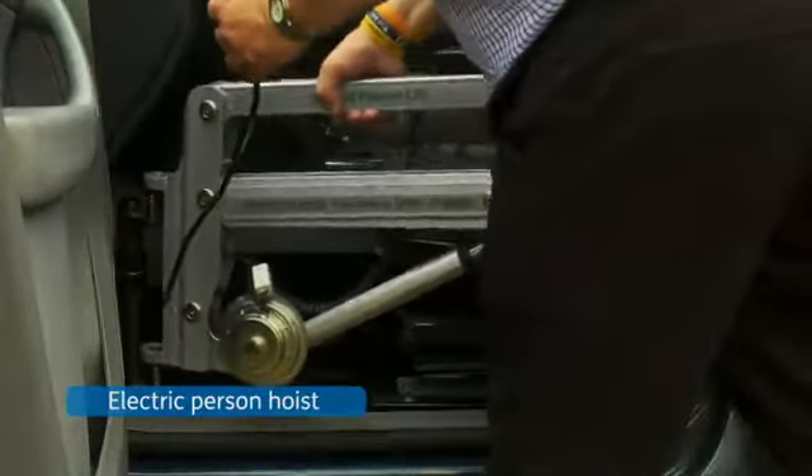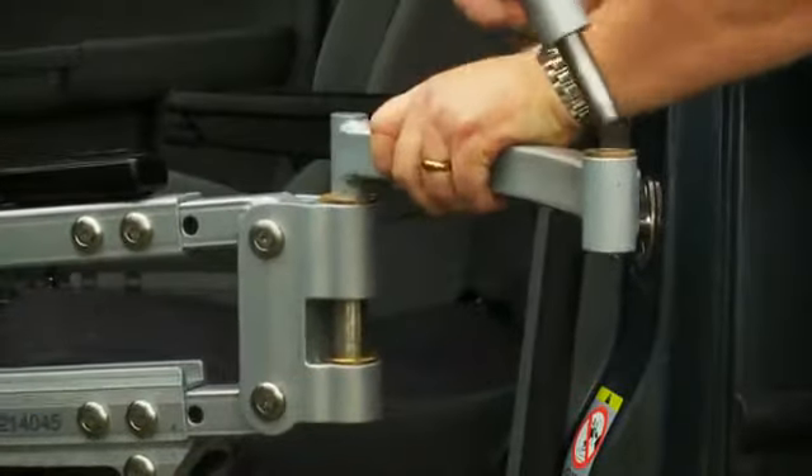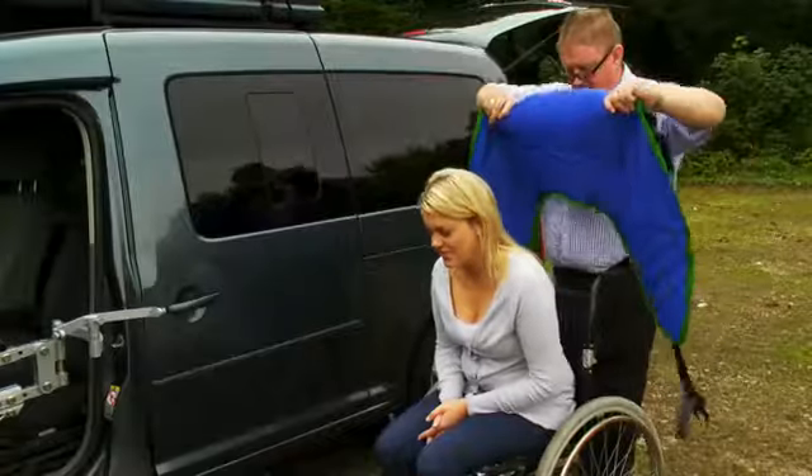The electric person hoist physically lifts you into the car. The hoist includes a permanent mount fitted into the car and three easily assembled parts which clip together to form the frame.